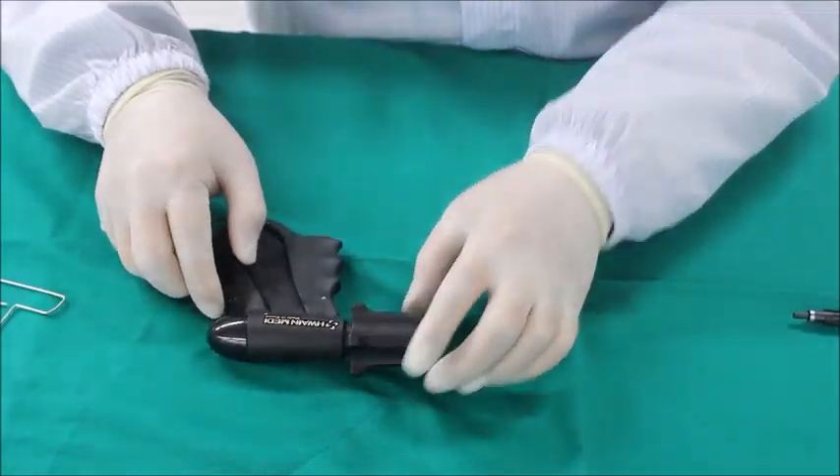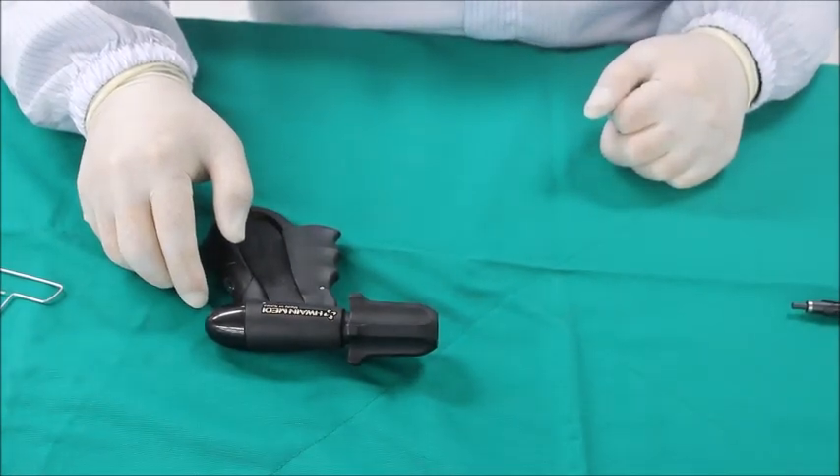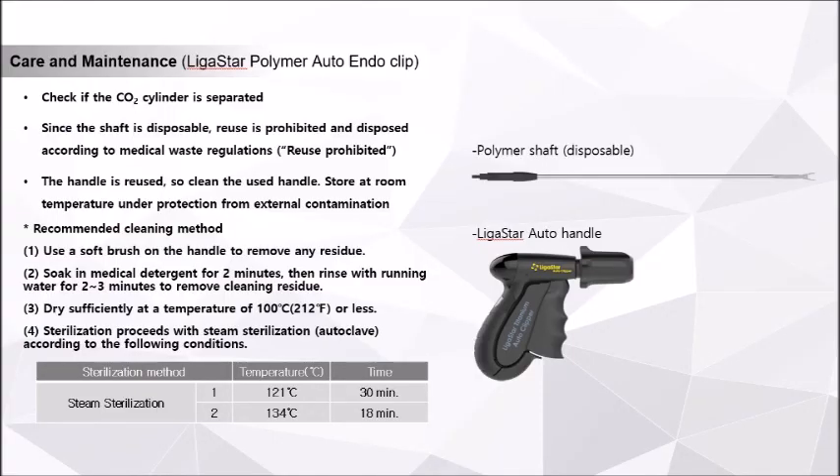The recommended cleaning method for the handle is to remove residue using a soft brush, soak in a medical cleaning agent for 2 to 3 minutes, then rinse in running water for 2 to 3 minutes, and dry at a temperature below 100 degrees Celsius.